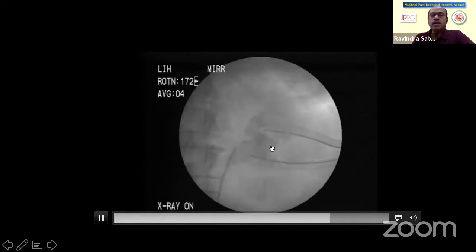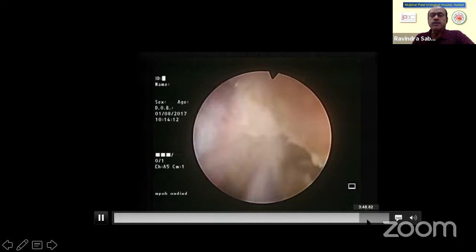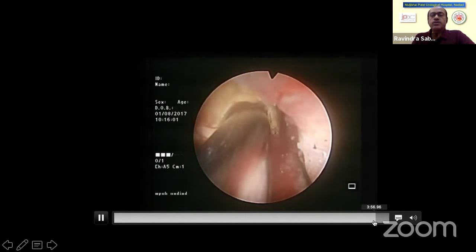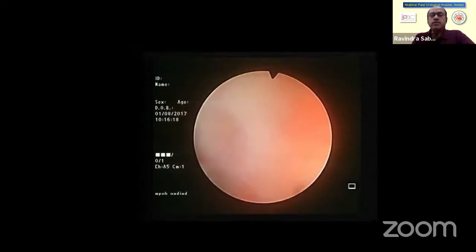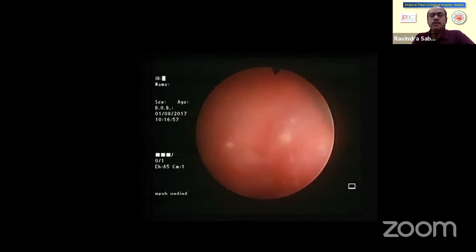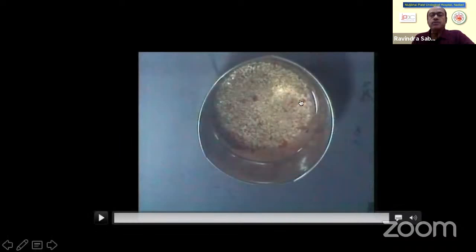This patient had an unapproachable upper calyx, and a third puncture was required, and that also was dilated. And you can see that that stone also is being completely cleared. So the advantage of the Shock Pulse is that even though it's a staghorn stone, because it works very fast, the suction can be very effective, fragmentation is fast, and therefore such a big stone can be completely cleared in one stage. And at the end, you can see that these are the fragments which have been sucked out through the probe. So that is how the Shock Pulse can be used.